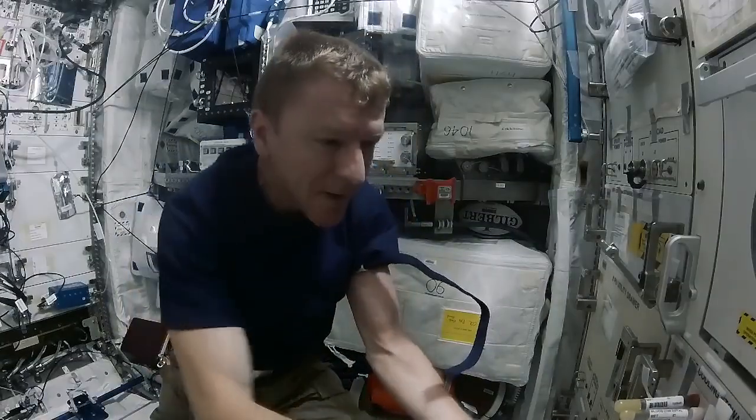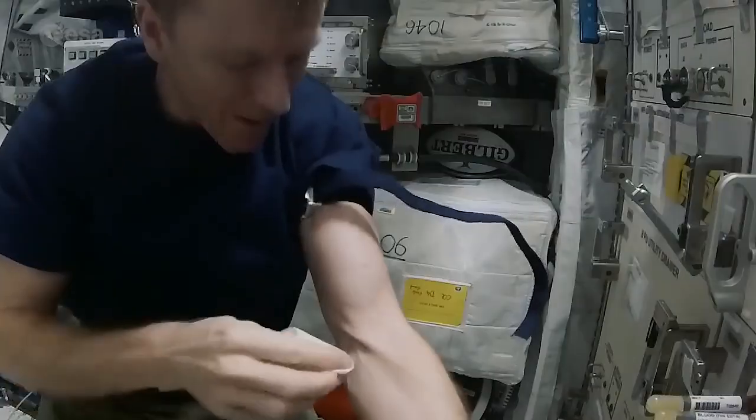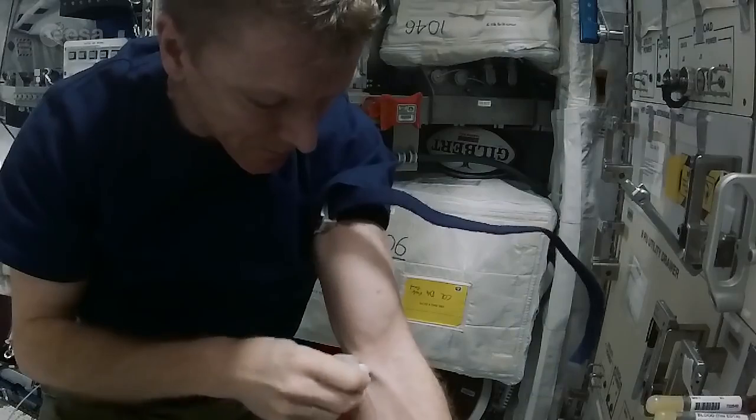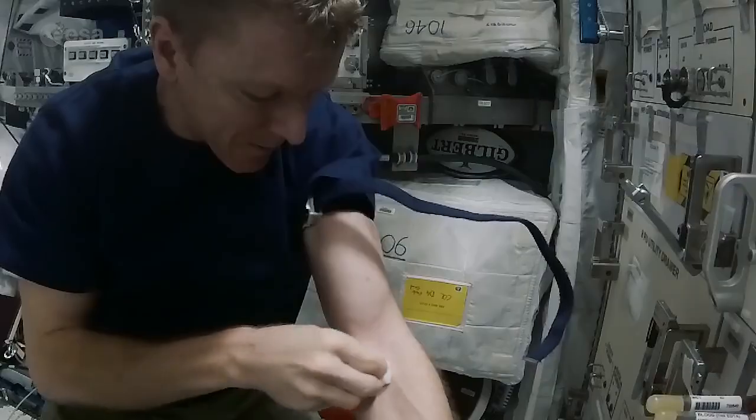Find a good location — thankfully I've got quite a big vein, so for me it's quite easy. And then just clean the location, starting at the center and working out.